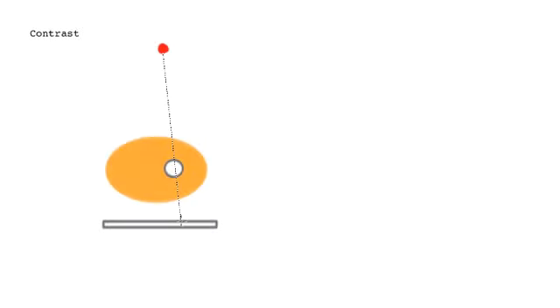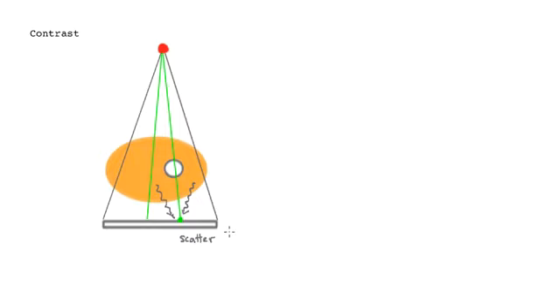So the goal of distinguishing contrast is to be able to tell the difference between the attenuation along these two ray lines, right? That's the goal of imaging contrast. So remember now that the field is quite large though. And so because of that large field, you get scatter of photons from different parts of the field towards this pixel of interest. And so that scatter is an extra signal, an unwanted signal, that doesn't give you any information about what's inside the patient. It's just sort of a background fog. More photons, but they're not useful photons.